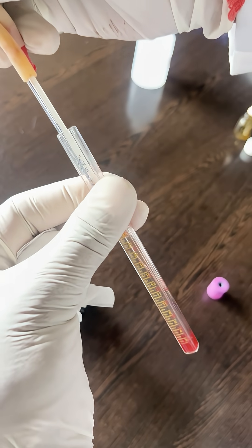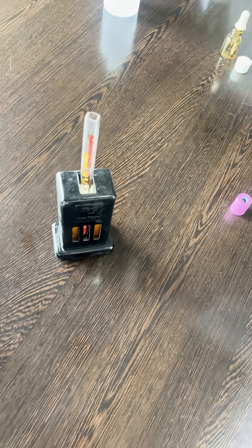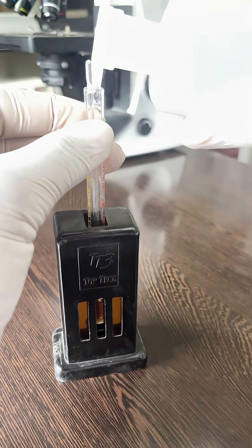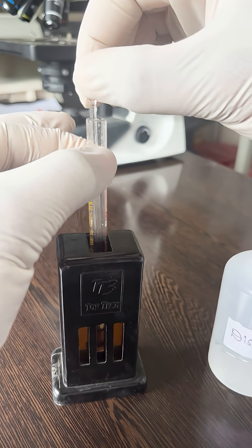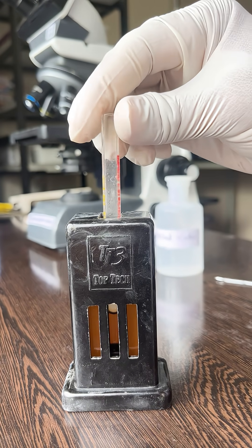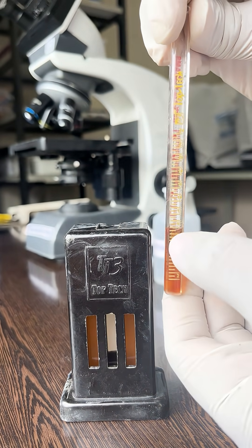Then mix it and wait for 10 minutes. After 10 minutes, add distilled water drop by drop and stir with the stirrer until the color matches against the standard brown glass comparator. Take the reading at the upper meniscus.